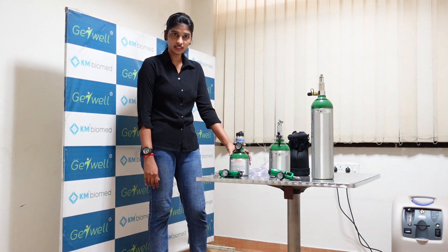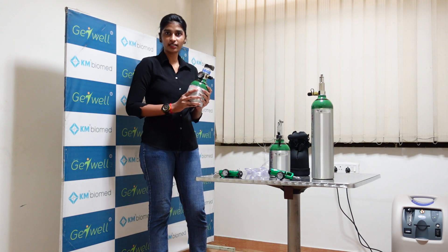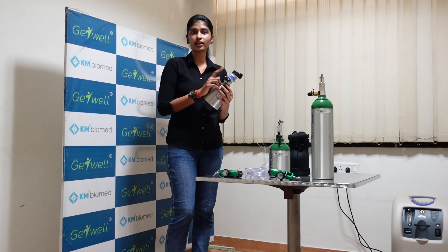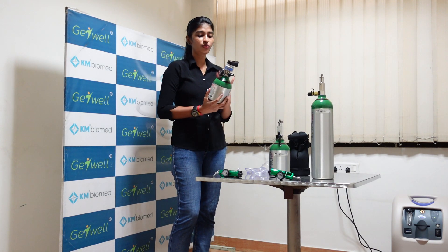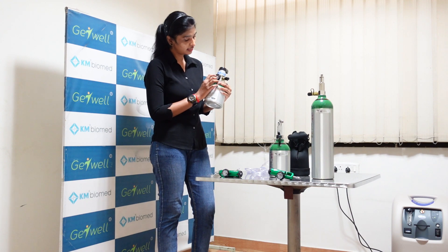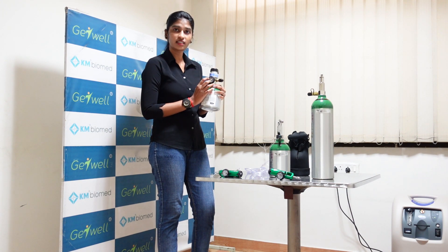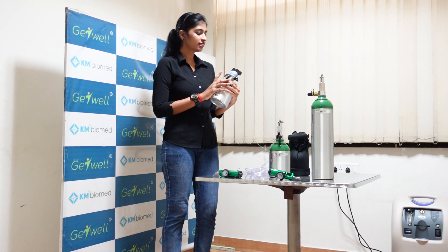This is the ML4 cylinder with a conserver device and it has an inbuilt regulator. This can be filled through the InvaCare HomeFill oxygen system. This nipple will go to the HomeFill system and it gets filled. This is the regulator part — the pressure gauge will show whether it is filled or not. If it is not showing any gas, you need to fill the cylinder. This is the indication.